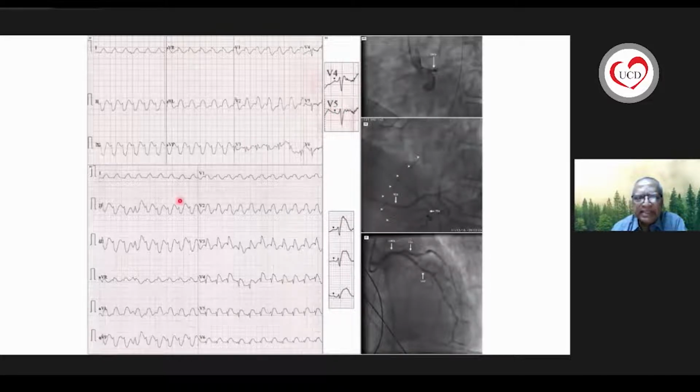If this is accompanied by an ST elevation in AVR, this may suggest a left main occlusion, which should not be mistaken as VT, because these patients very often come to casualty with very rapid tachycardias, repeated shocks, and amiodarone is started, missing the underlying diagnosis in these patients.